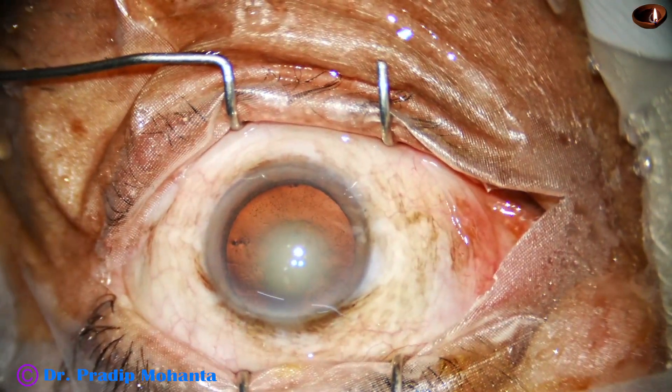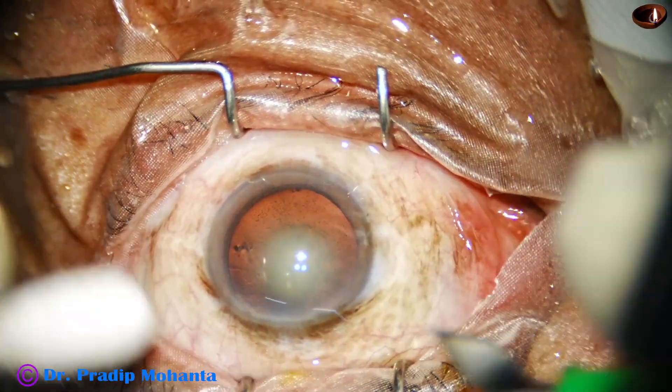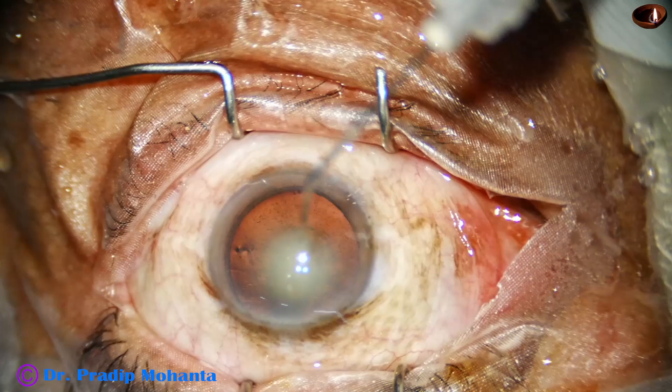Friends, let us observe a totally unedited direct chop FECO.